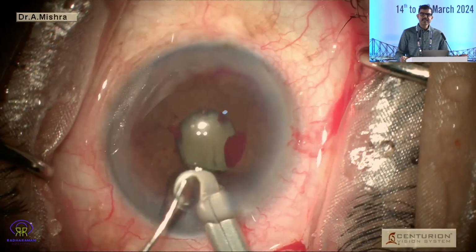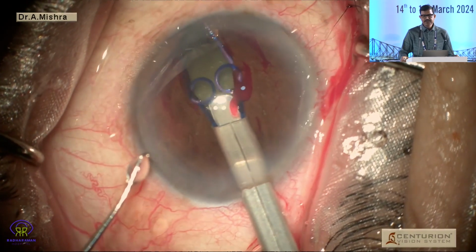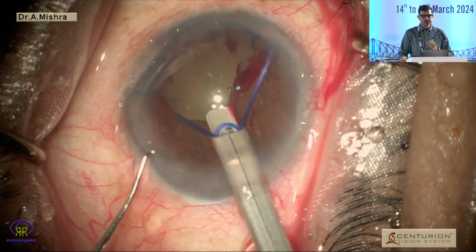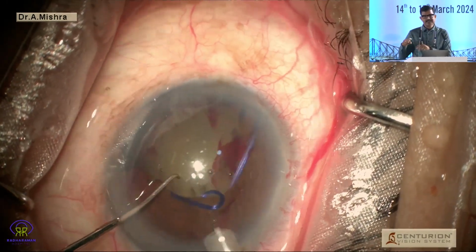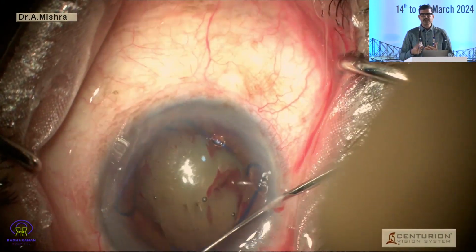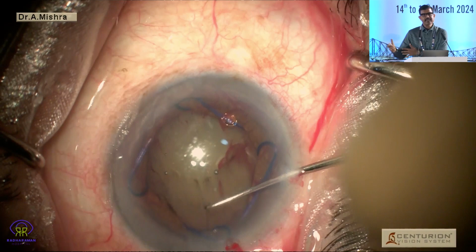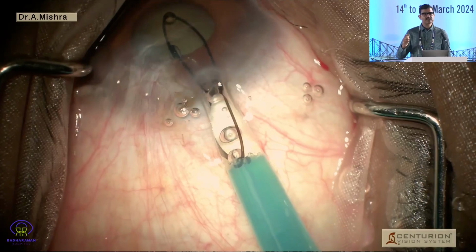The Mulligan ring is a 5-0 polypropylene, the go-to device, at least for me. The technique of injecting it is the distal scroll should be engaged first at the distal side. The side scrolls, if engaged simultaneously while the ring is being engaged, it is fantastic, because then you have only one scroll left which you can engage from the other side. And then after all the scrolls have been engaged, it has got an 8-point fixation. Fantastic device indeed. And once they're all engaged, you can reshape the pupil and bring it back to the central point for your convenience.